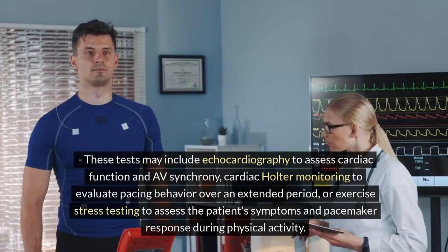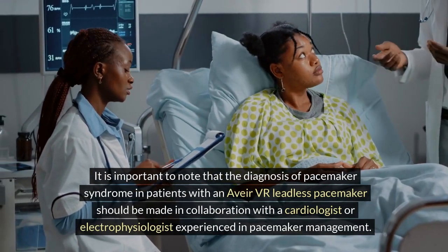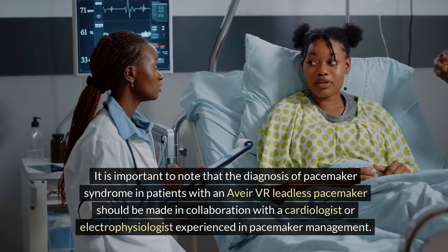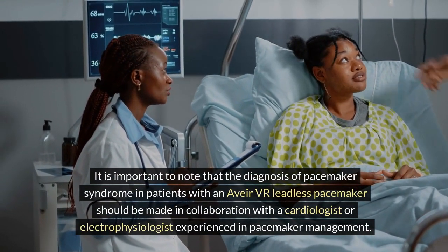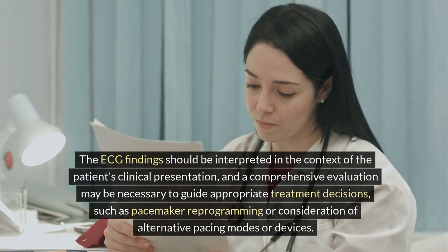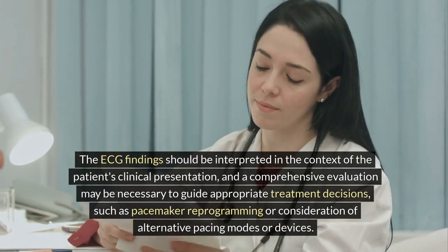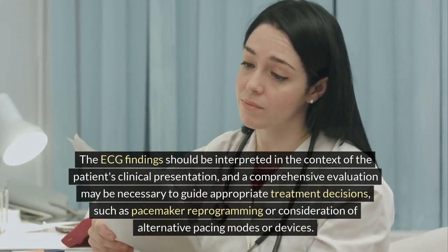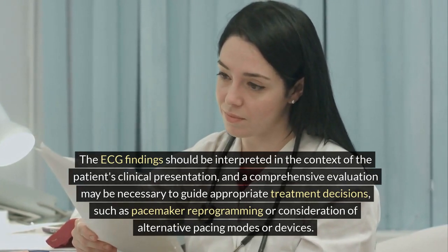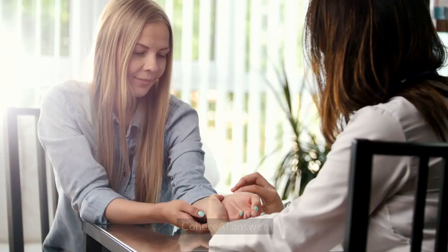physical activity. It is important to note that the diagnosis of pacemaker syndrome in patients with an Aveir VR leadless pacemaker should be made in collaboration with a cardiologist or electrophysiologist experienced in pacemaker management. The ECG findings should be interpreted in the context of the patient's clinical presentation, and a comprehensive evaluation may be necessary to guide appropriate treatment decisions, such as pacemaker reprogramming or consideration of alternative pacing modes or devices.